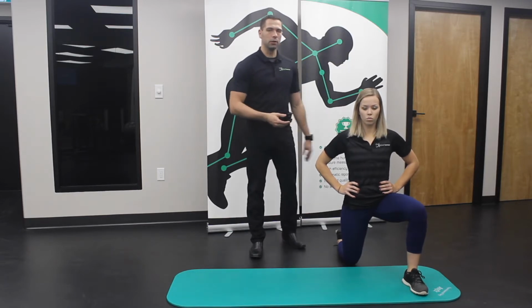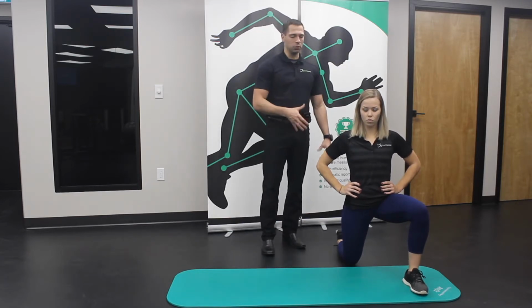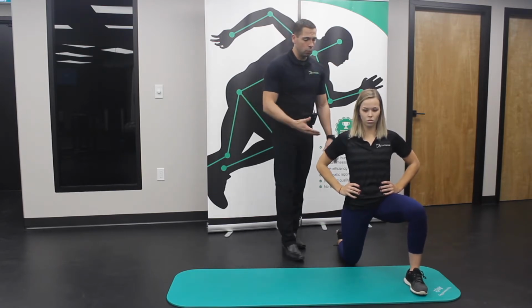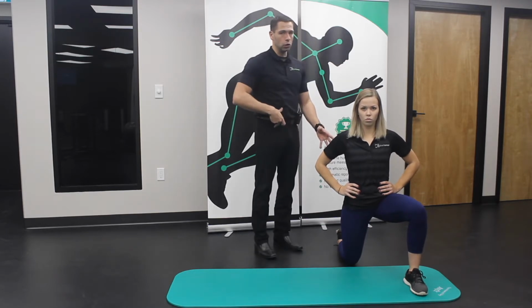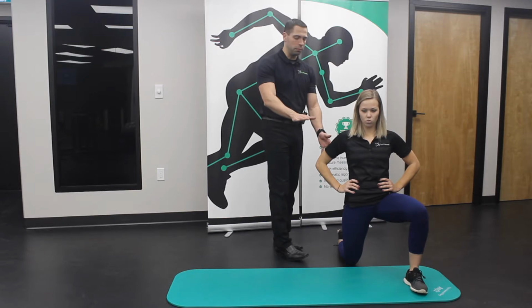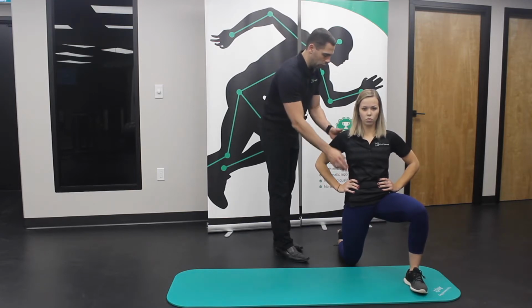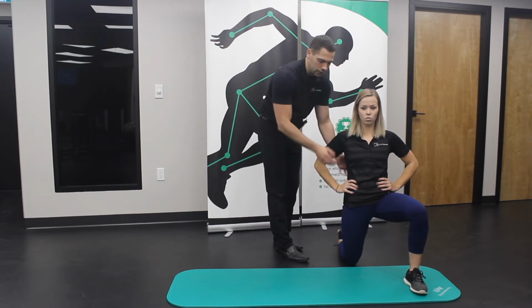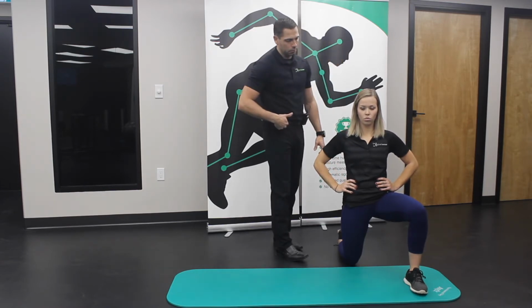So we have Maggie here. We'll do an assessment quickly. Here we're assessing the right hip because the right hip is down in that split position. First thing we want Maggie to do is try to lock out the front of the hip, going into a posterior pelvic tilt. Automatically, once she goes into that posterior pelvic tilt, we get flattening of the low back. She can feel tension in the front of that hip.